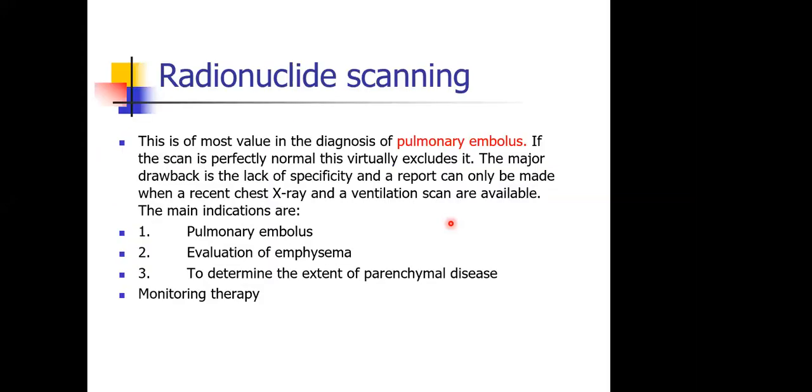This morning, we are going to address the other remaining imaging modalities along with other issues that are going to come up. And we are going to start right away with radionuclide imaging or nuclear medicine.